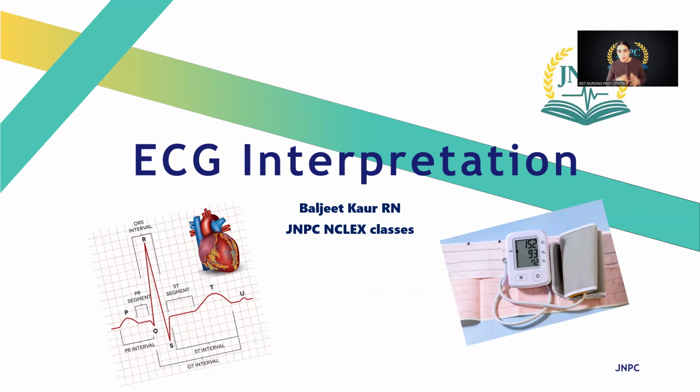Welcome back, everyone. Today we are going to talk about ECG, a lot of cardiac rhythms, cardiac dysrhythmia, and how to interpret ECG. Because on NCLEX, they're going to give you just a strip like that, and then you have to assess what kind of rhythm it is, what kind of treatment we should be following, what we should anticipate in that strip, what the treatment plan will be, right?